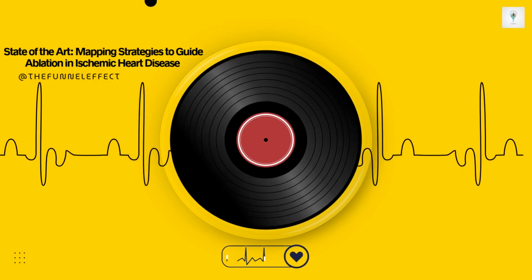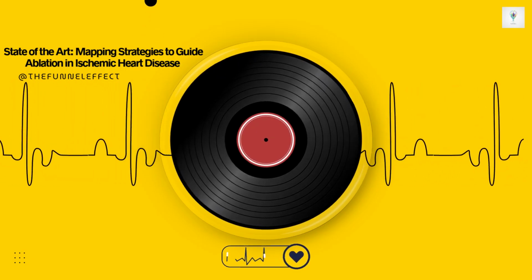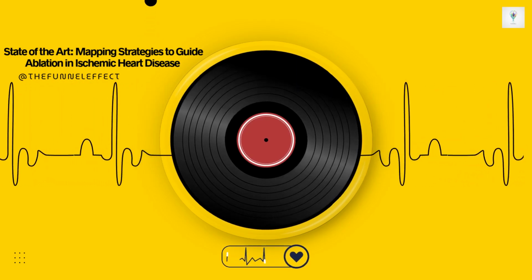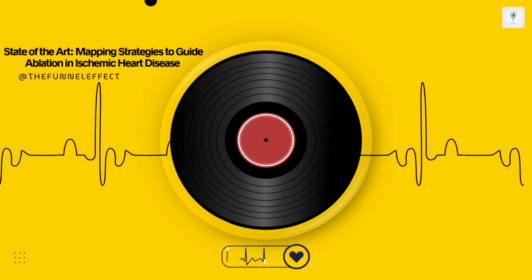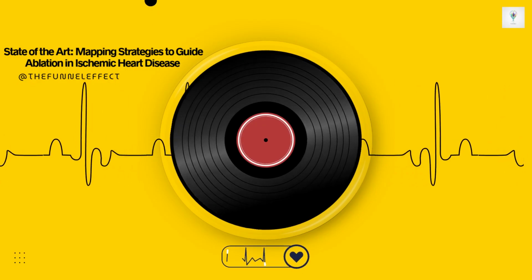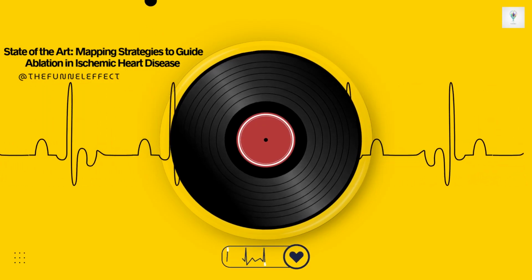Second is mechanical interruption. Sometimes just the physical pressure of the catheter tip against the endocardium can terminate the VT. If this happens cleanly, the VT stops without triggering a burst of extra beats or chaos, ventricular ectopy. It strongly suggests your catheter is physically bumping or compressing the fragile critical fibers of the isthmus. It's like blocking the road just by parking the car there?